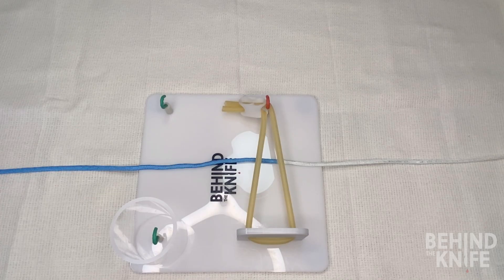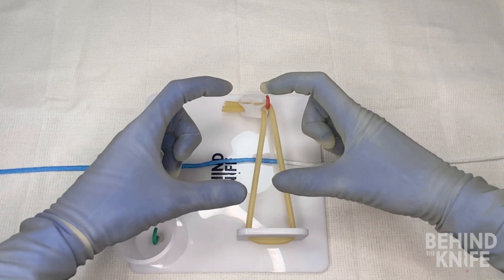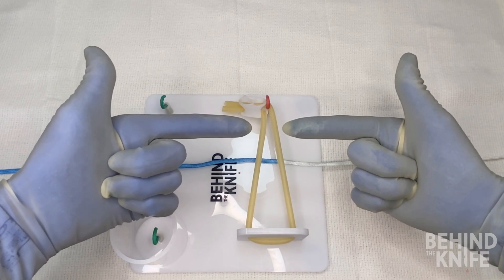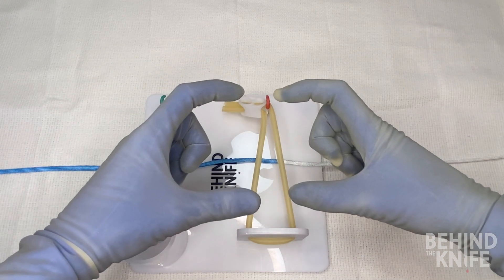The key to making this knot is making L's and C's with our hands. For the beginning part of this knot we're going to make two L's with both our hands, and when we move on to the second part we're going to make two C's with both our hands.